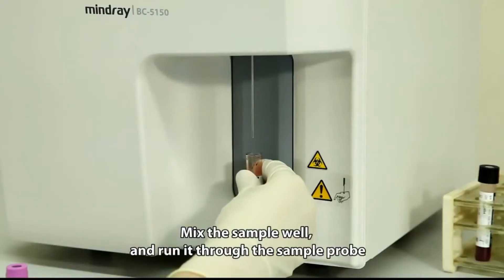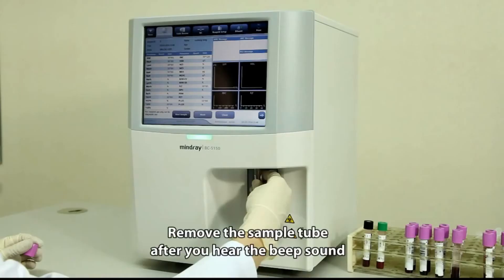Mix the sample well and run it through the sample probe. Remove the sample tube after you hear the beep sound.